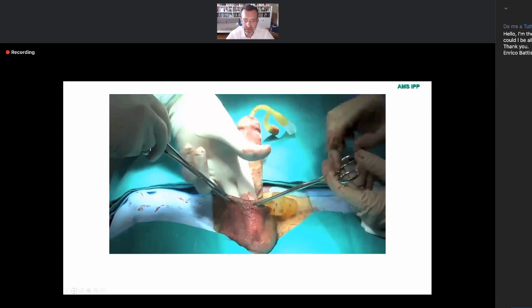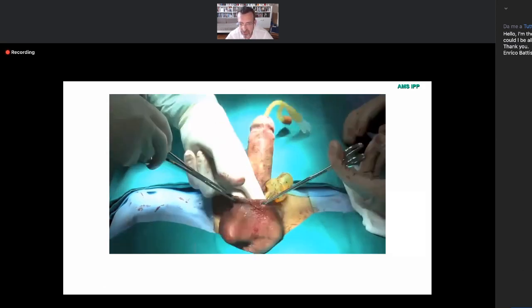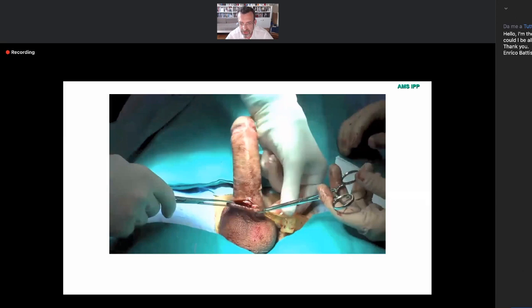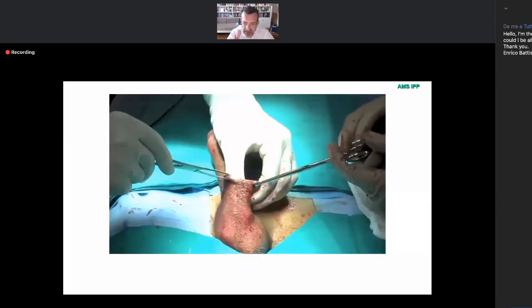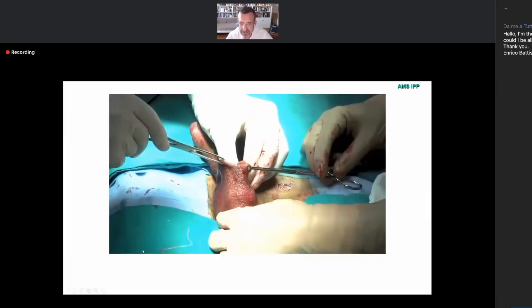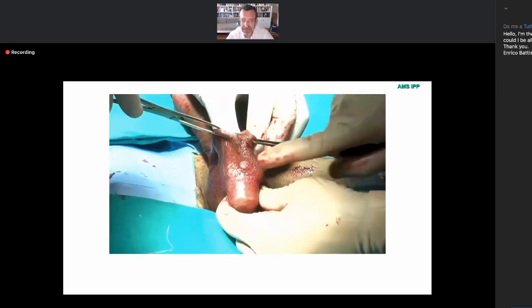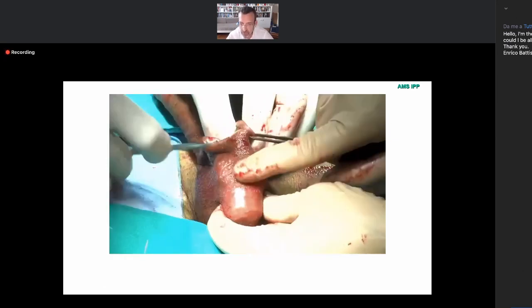You can run the video, please, Russell. We can at this time do the pocket for the pump. You put the pump in the medium part of the scrotum, posterior to both testicles, but in a way that the patient is able to feel the pump part and the deactivation button. This is the way. After this, you can leave or not leave drainage.